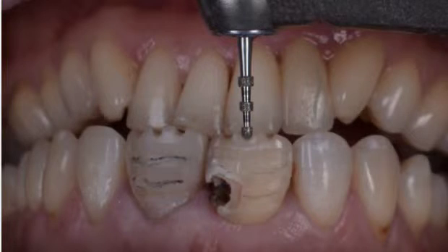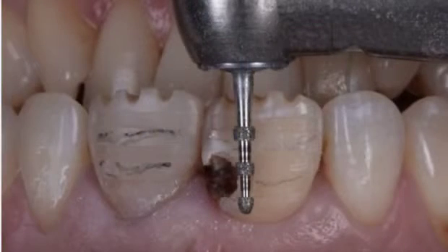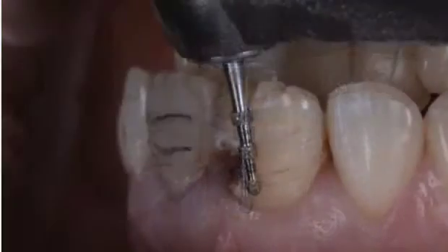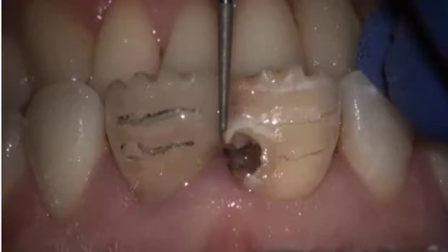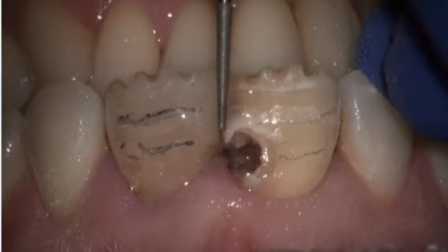How it was on images. Close look and a different angle, and then other steps for crown preparation, like separation and the creation of the main amount of cut.